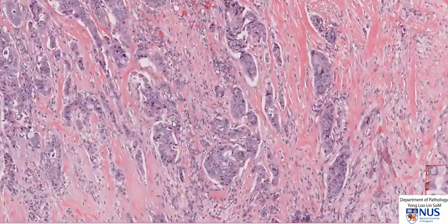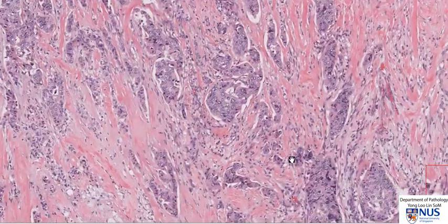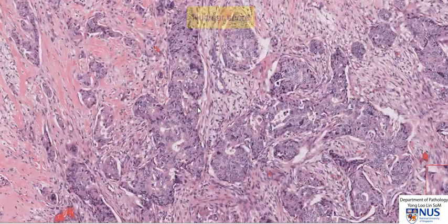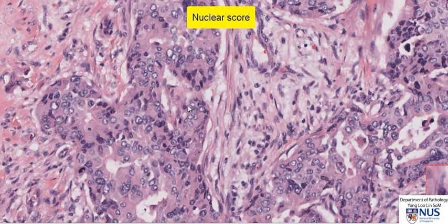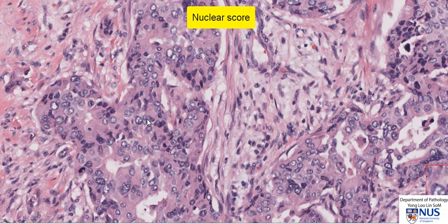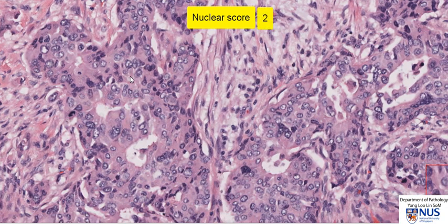Now let's look at a well-preserved area for the nuclear score. If you look at the nuclei, they are moderately pleomorphic — not wildly pleomorphic, yet at the same time not very well differentiated. Hence, the nuclear score will also be 2.